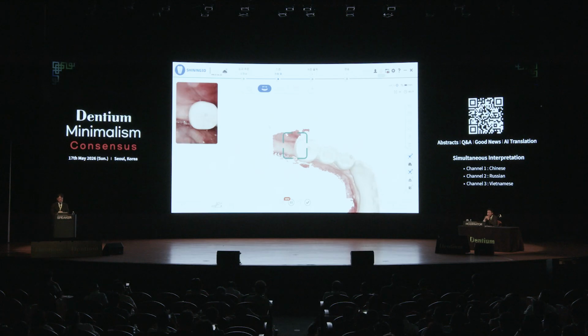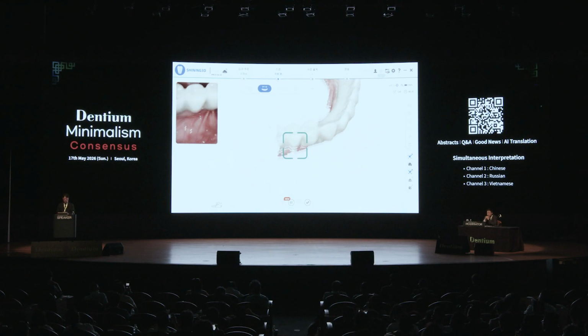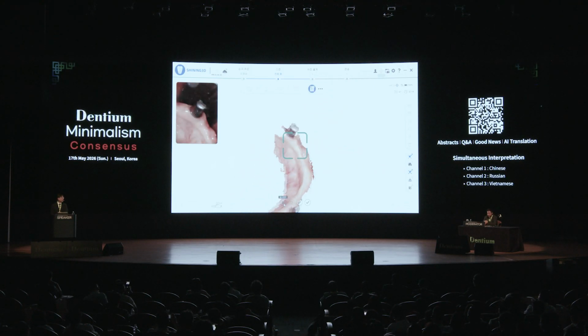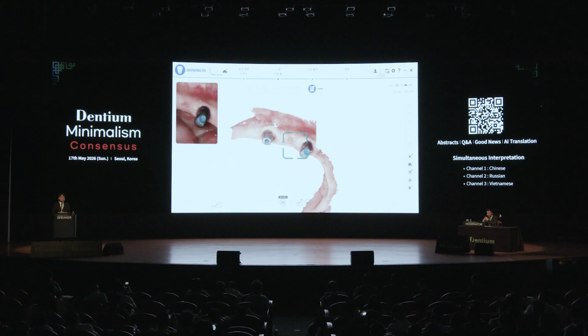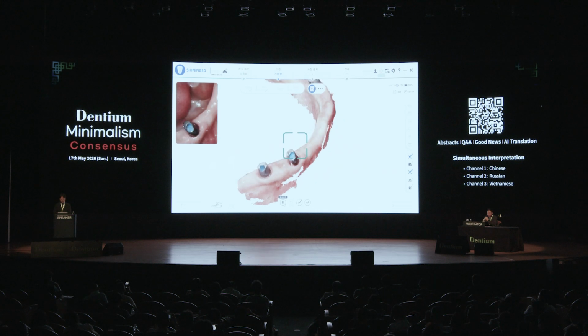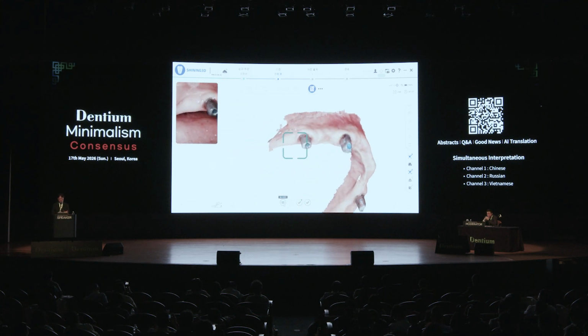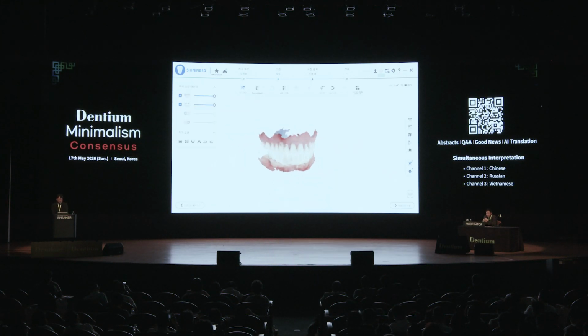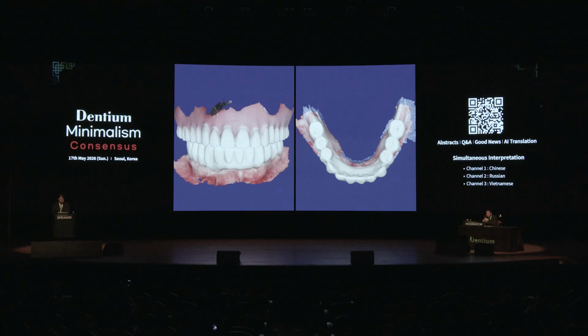Now it's time to make the final restoration for the mandible. This video clip shows scanning of the mandibular provisional restoration and custom abutment with the Aoral Scan Elite. Compared with the previous version, Aoral Scan 3, the Elite is clearly smaller and lighter. Scanning is faster, and it seems easier to scan a larger area at once. Occlusal information can be obtained using the provisional restoration as a reference. The provisional restoration and custom abutment scan data can be aligned either manually or automatically during the scanning process or in CAD software. In this process, we use the CAD program.